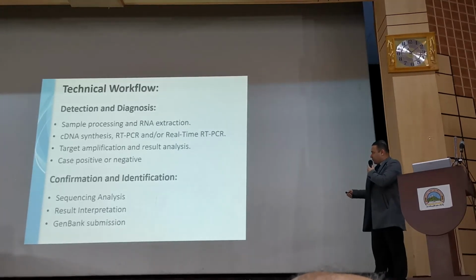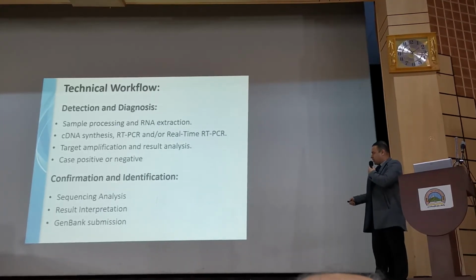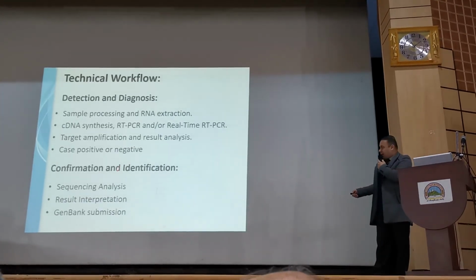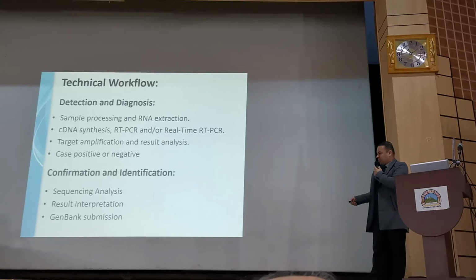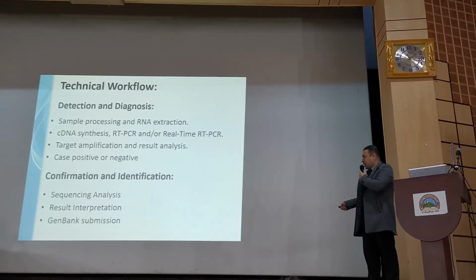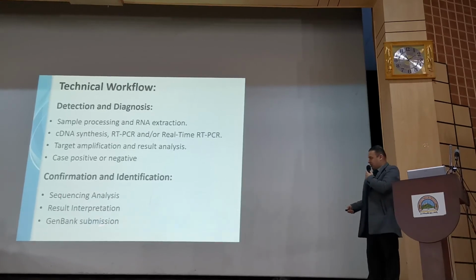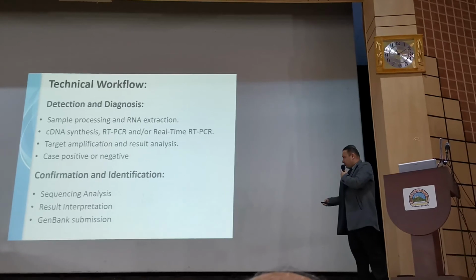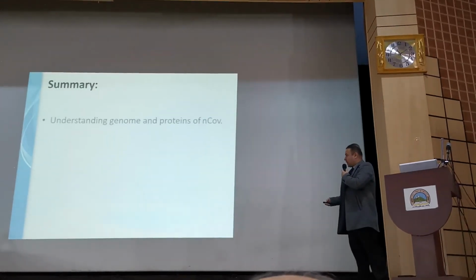After that, the confirmation and identification can be done by sequencing analysis, and we have a variety of methods, either standard sequencing or next generation sequencing, and doing result interpretation, and even submitting our results in GenBank, which is very important for our country.